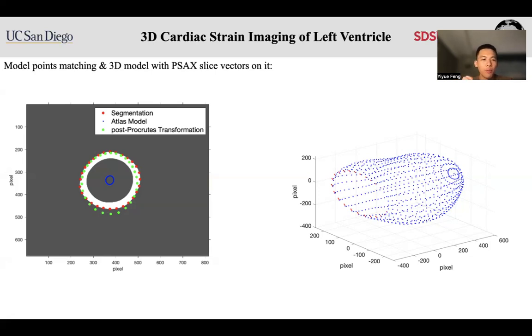So overall, this project introduced a very novel method to construct 3D smooth left ventricle strains from 2D B-mode images. The robustness of the 2D block matching algorithm has been enhanced by applying the principal component analysis method. The workflow in this project is particularly beneficial for researchers who are developing customized probes for strain imaging visualization. Future work will focus on calibration between different views to make this algorithm better at dealing with a wider range of B-mode images.